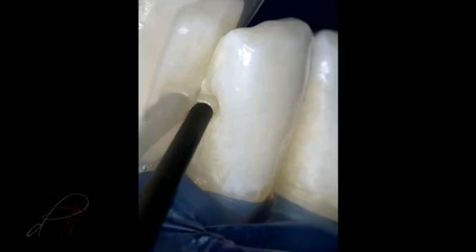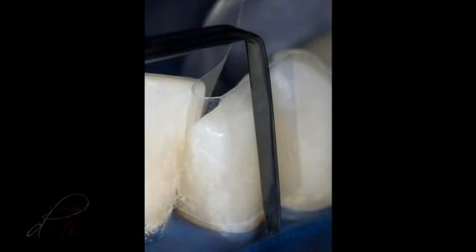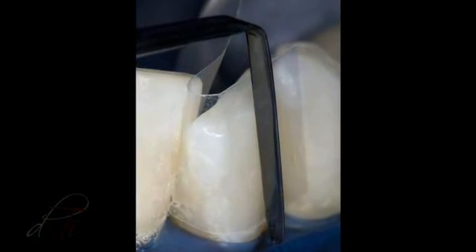A bleach-shaded flowable composite material, Genial Universal Flow by GC America, was injected into the preparation and the syringe tip was slowly removed while extruding the material. The mylar strip was firmly adapted to an ideal contour and light-cured for 40 seconds using a ramp mode.